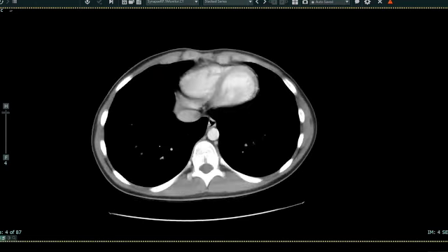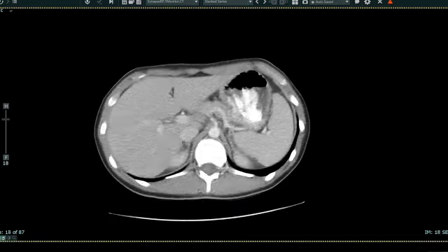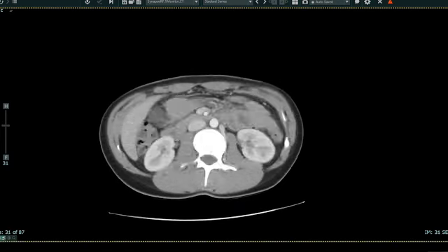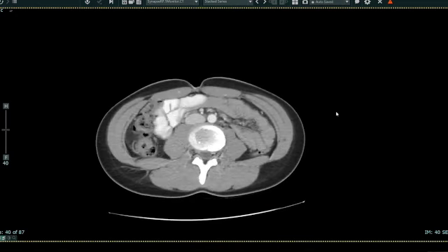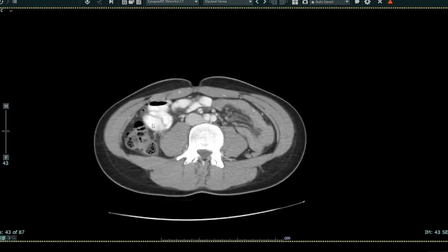Now I'm going to scan more inferiorly. As I come down, we see the patient's liver here, the patient's spleen, and this structure here is the stomach. Coming down more inferiorly, we see the right kidney and the left kidney. As we get further down in the abdomen, we start to see bowel loops. These brighter loops are loops of small bowel — the patient drank contrast, and that makes the small bowel loops brighter.